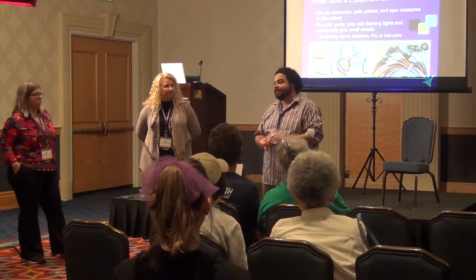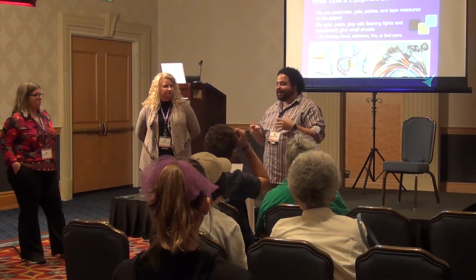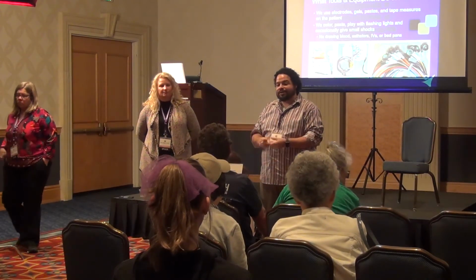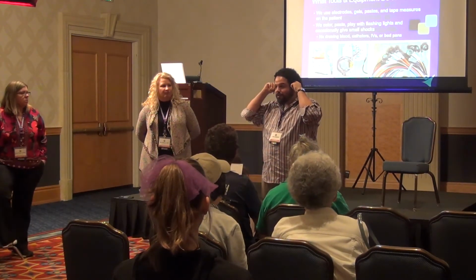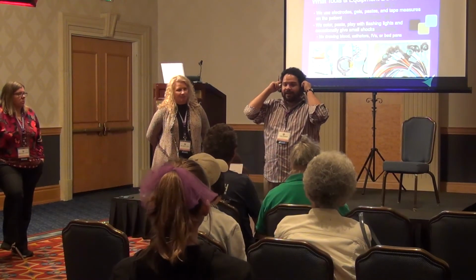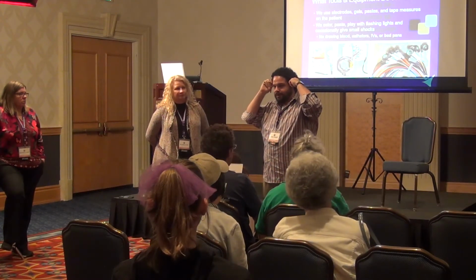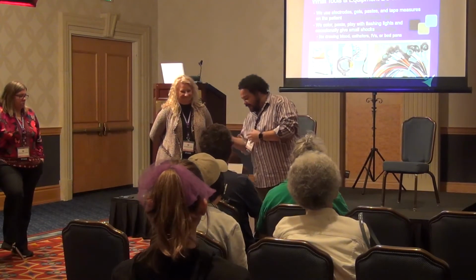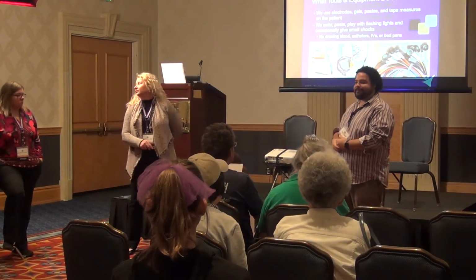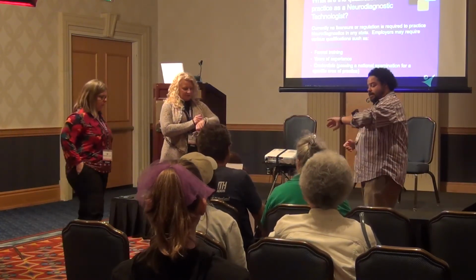The reason we do this is because people in this field have learned over time that certain parts of your brain are specific to certain activities, and certain seizure activity happens in certain parts. So we want to make sure that we record them properly so that they're symmetrical. Like Mary said, different parts of the brain do different things, but they should be doing the same thing on each side of the head. So this way we can compare. If someone has temporal lobe epilepsy, we want to make sure we're comparing their temporal lobe to the temporal lobe on the other side, right? And these are just some of our tools that we'll use to make sure that we have everything on properly. There are different types of pastes, and some are easier to get off, others aren't.